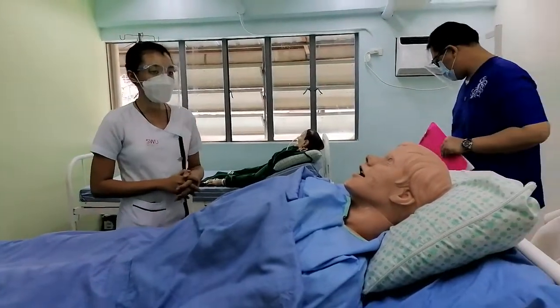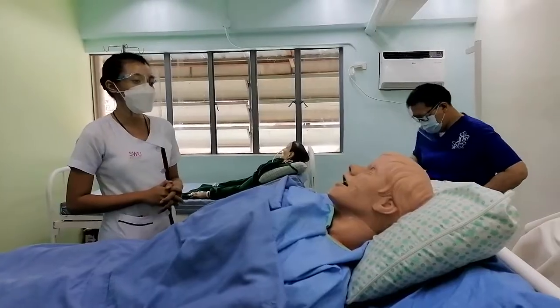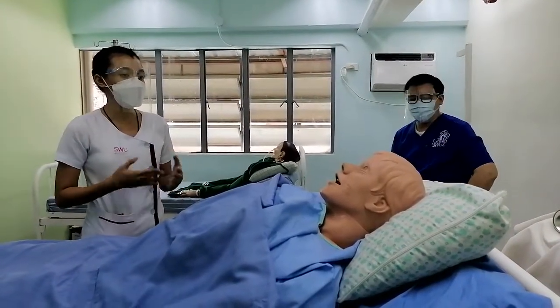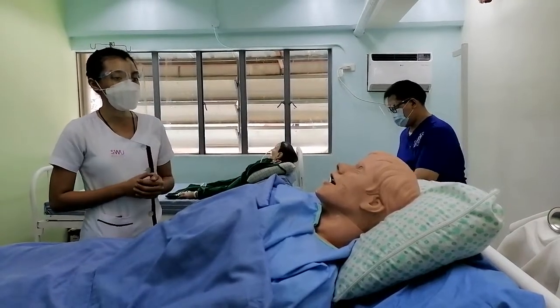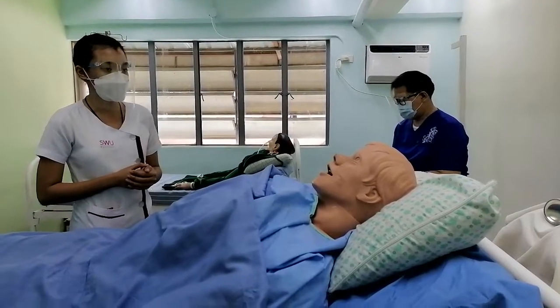Identify the patient's need for enteral feeding. This is to identify that the patient cannot voluntarily provide feeding to itself. That's why the nurses will provide the feeding through the tube. Next, we will assess the nostrils for patency and also check for skin damage.